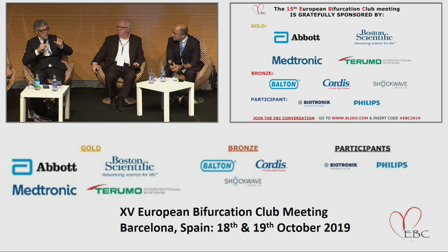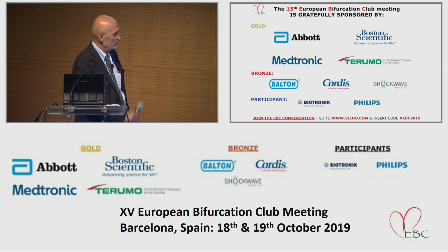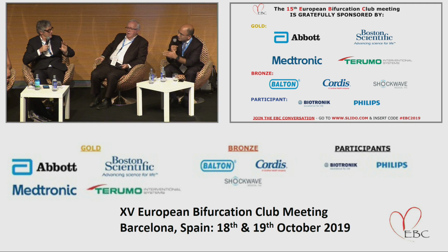So the question was not should we do a kiss. The question was should we open the strut toward the side branch. It can be a POT-side-POT. It can be a kiss. In provisional stenting. So we are not talking about two-stent techniques. Yeah. But Dr. Chevalier added some data about the detrimental impact of kissing if you do it in the left main. So I'm just pointing towards what you said, that if we open, maybe just a dilatation and a final POT, if we want to be safe.